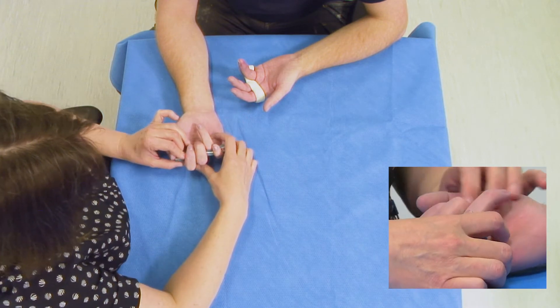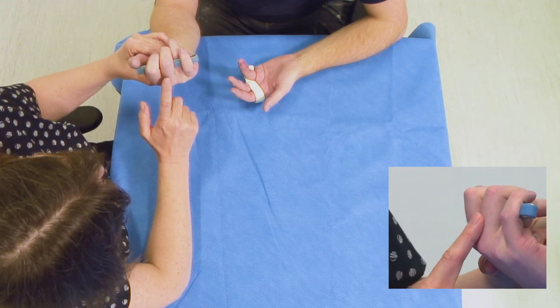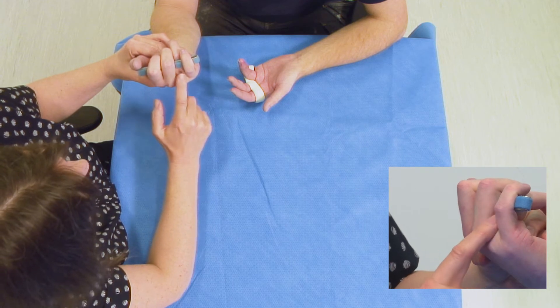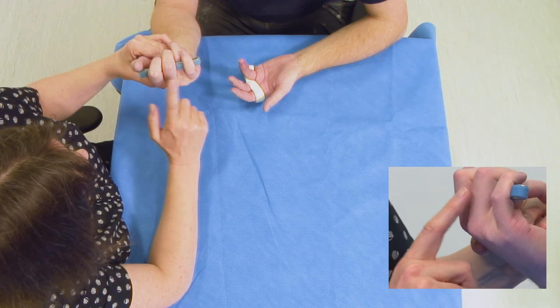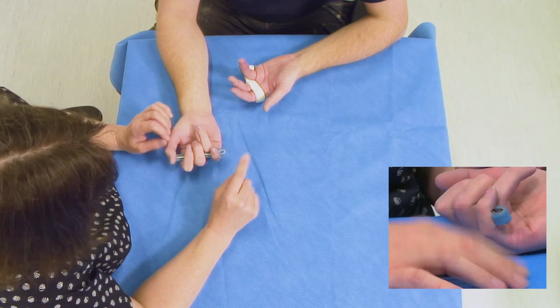We can see from that the angle of difference that we need between the uninjured digit and the injured digit in order to determine that we can put a splint on that will safely prevent a lot of movement on the injured finger.